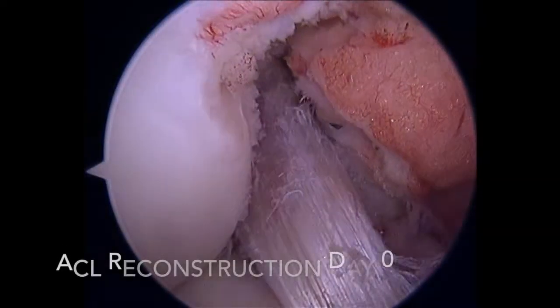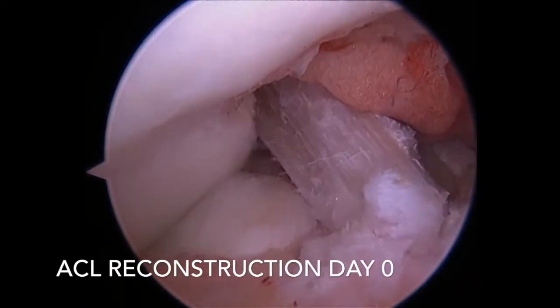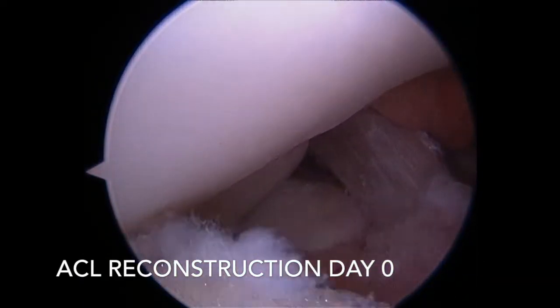Now we have a hamstring tendon graft that has just been used to reconstruct the torn ACL going through the same range of motion.